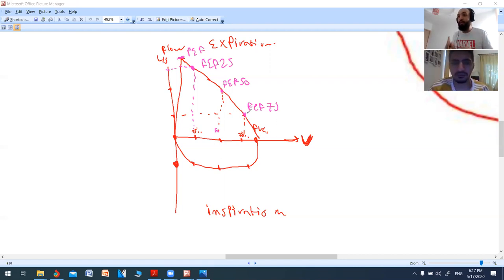Which of them do you think depends on the effort, the physical effort? The first two or the second two? The first two. It depends on the effort. So that's why I have to push the patient. Breathe out with all your force. Do it, do it, do it. More, more, more. But the most important thing is also to breathe out with all his force, because if she does like this or he, look.